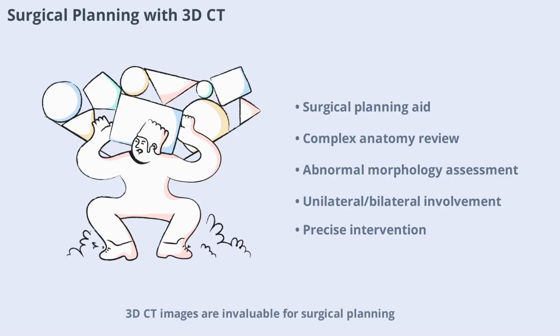3D CT images are invaluable for surgical planning. Surgeons can review complex anatomical relationships, delineate abnormal morphology, and assess the relative position of structures. The technique provides information about unilateral or bilateral involvement of lesions, aiding in precise surgical intervention.